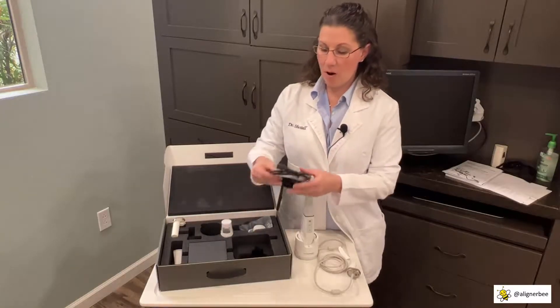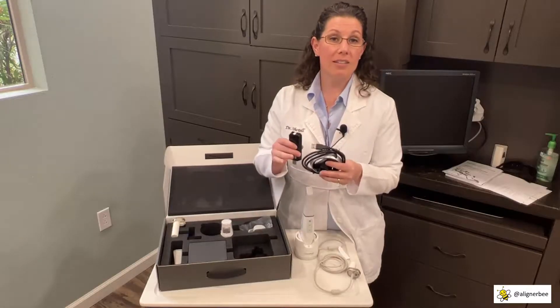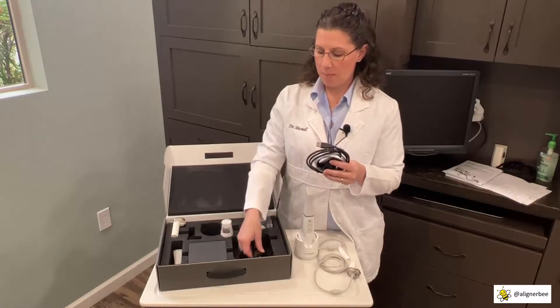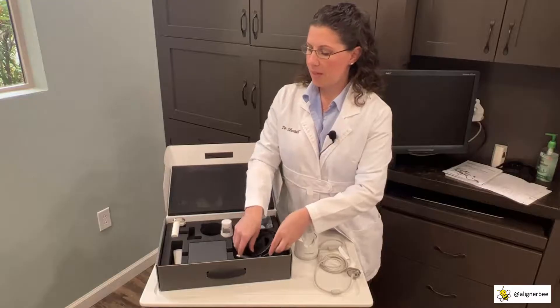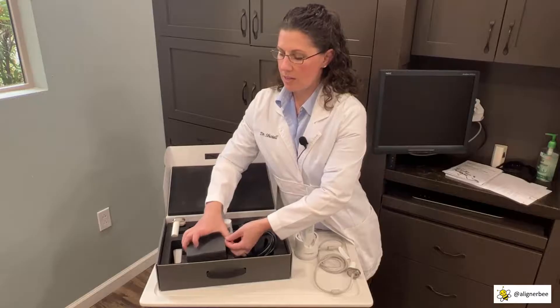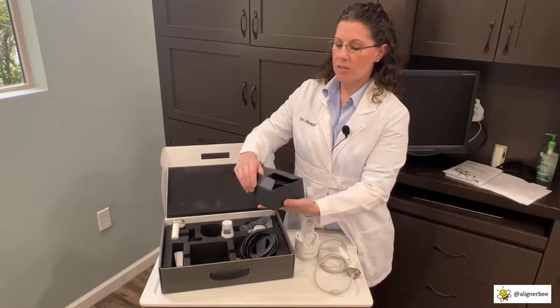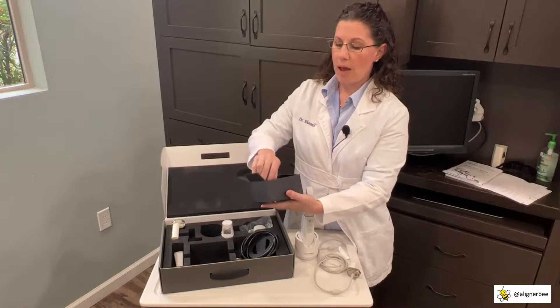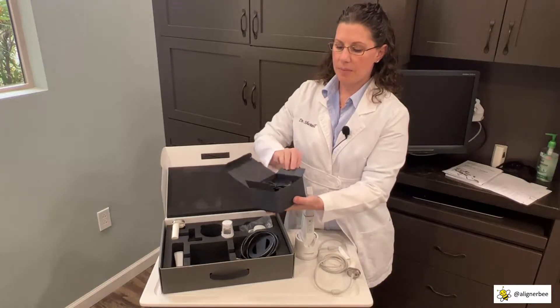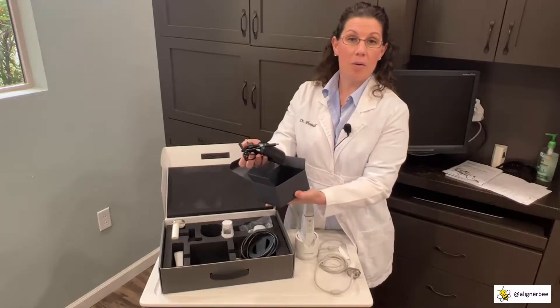We then have the power cords and adapters that connect the scanner to the laptop. For doctors overseas utilizing a different power source, there are quite a few power adapters along with the main power cord included in a small box.